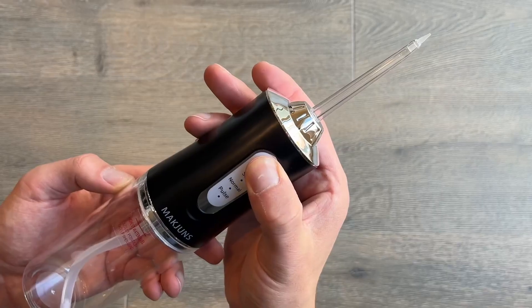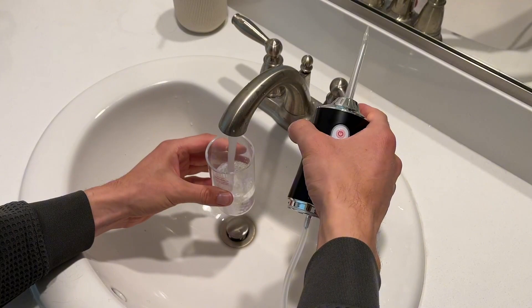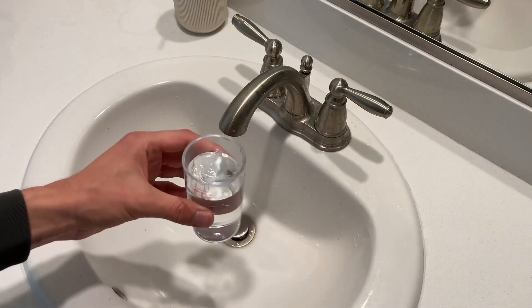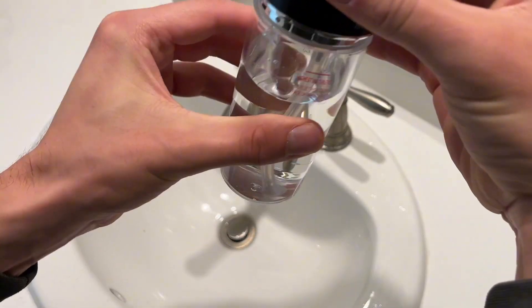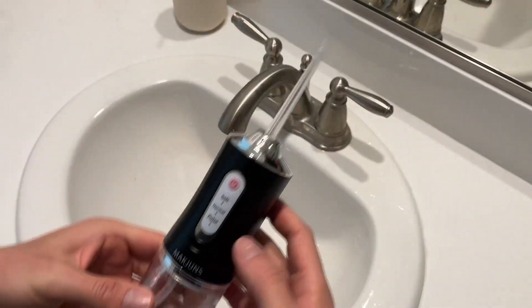It has different pulse settings depending on what you're trying to do — a steady stream and also a pulse function at different levels. This is waterproof, so you can clean it off easily. Just make sure the little dots line up and twist to the right — righty-tighty — and it will not spill out the water.